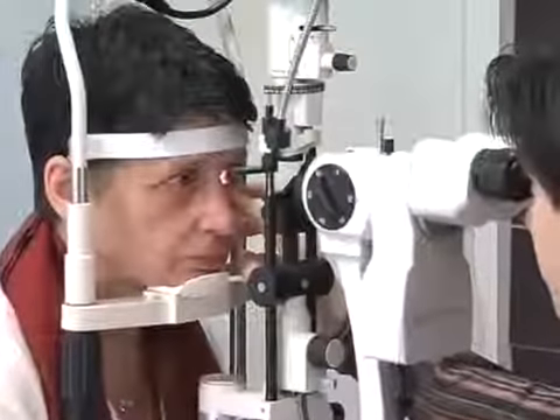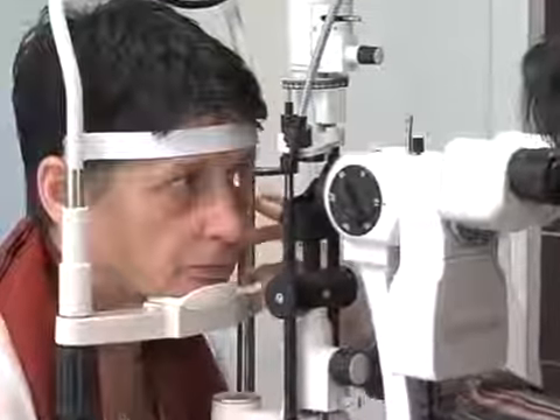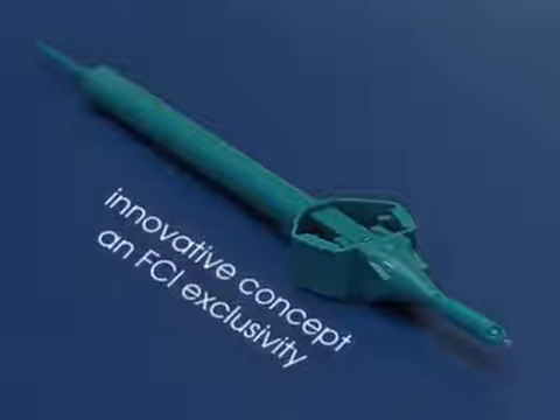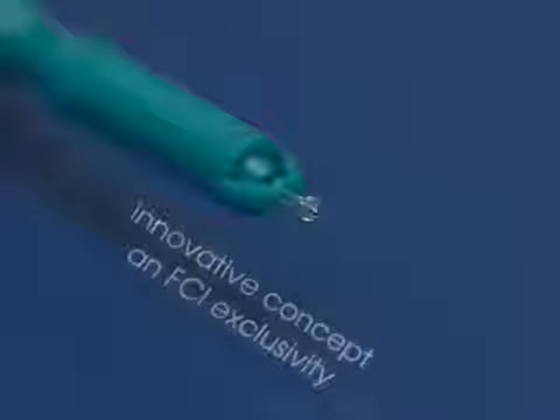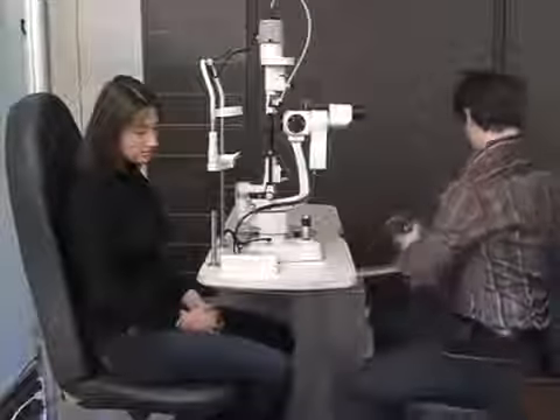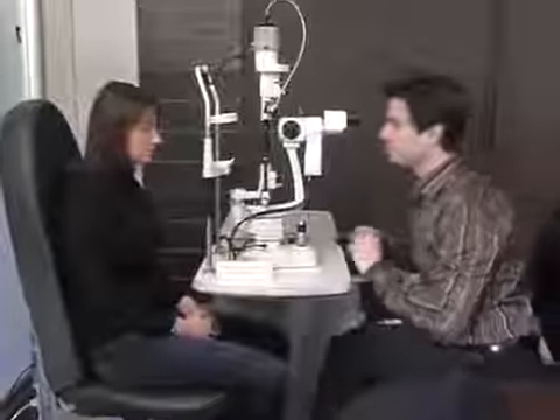The painless plug's innovative concept is based on the use of a single size plug pre-loaded on a plug inserter. The fitting procedure for the painless plug is simpler, quicker, and more effective than that for traditional plugs, which is appreciated both by practitioners and patients alike.